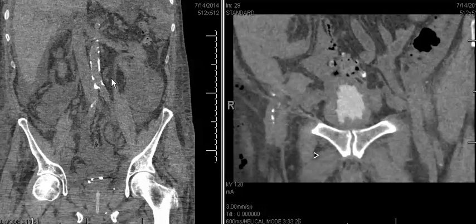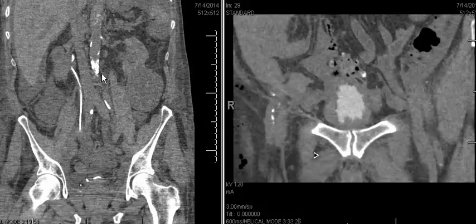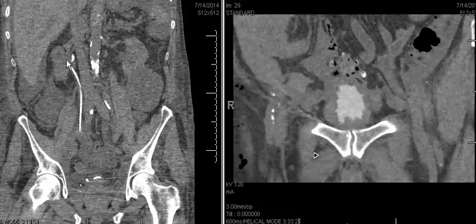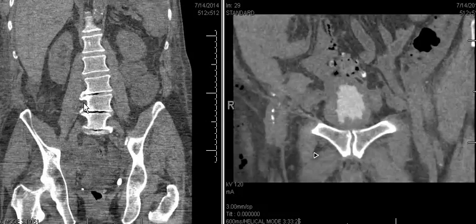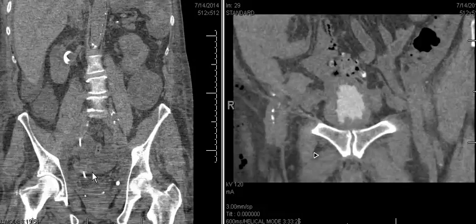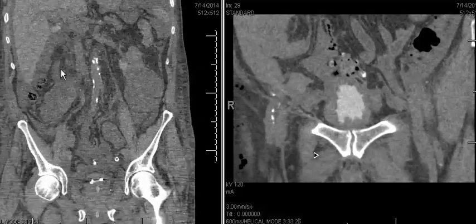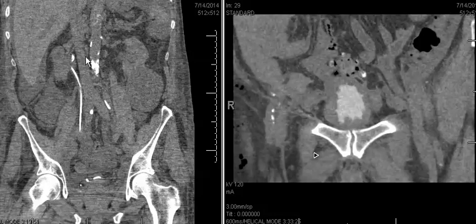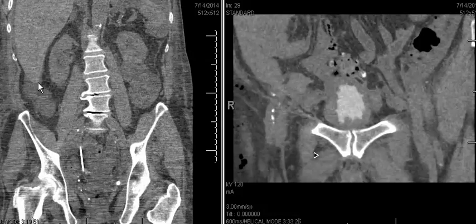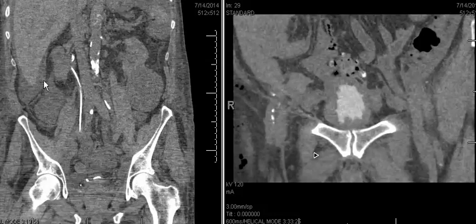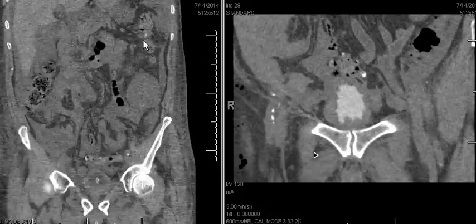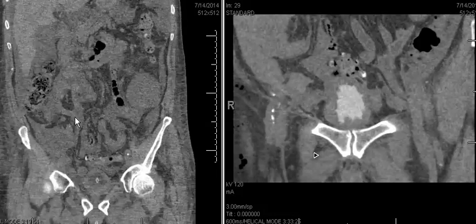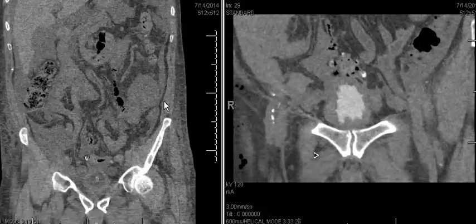Looking at the images on the left side of the screen, we notice that the patient has a nephro-ureteral stent extending from the right kidney going into the bladder, and also that there is a Foley catheter present within the bladder itself. Notice that there is free fluid around the liver and along the pericolic gutters bilaterally, all of which is located within the peritoneum.